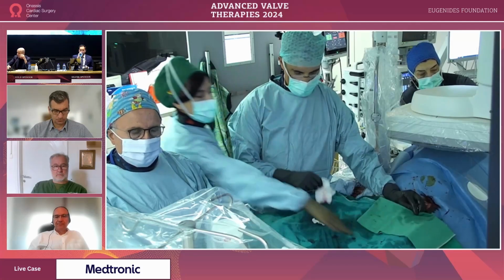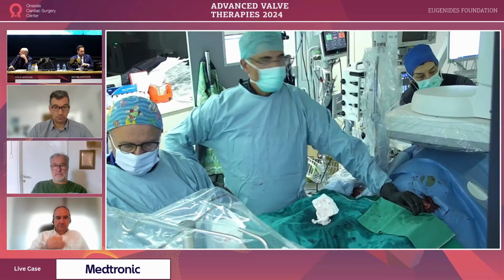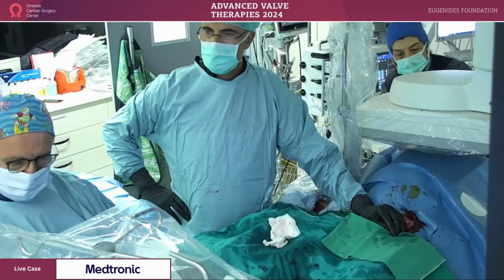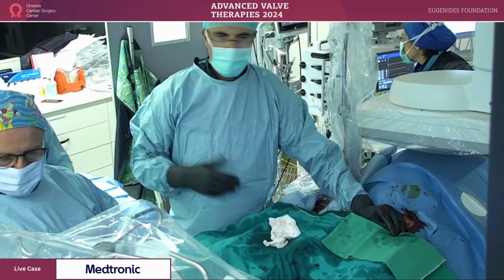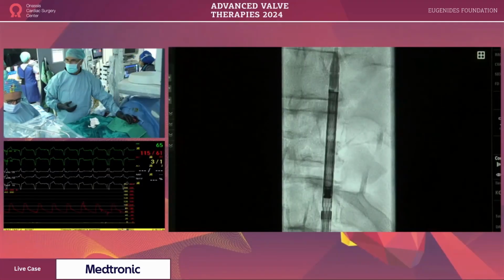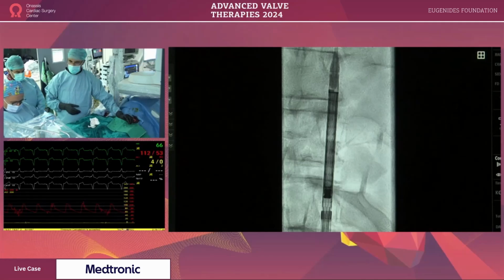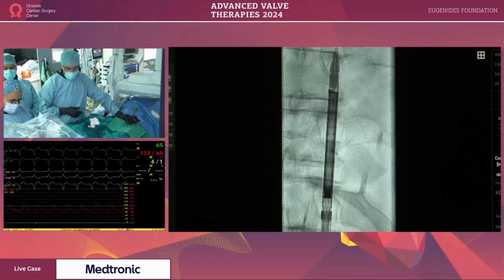Go right ahead, Yanni. Okay, hi George, good afternoon to everyone. I hope you can hear me. Very well, we can hear you. Good, excellent. I couldn't find anything better than a minimalistic TAVR after the lunch, right? So it's minimalistic, but not simplistic. This is a reference to the discussion that we had earlier in the conference with Arik.